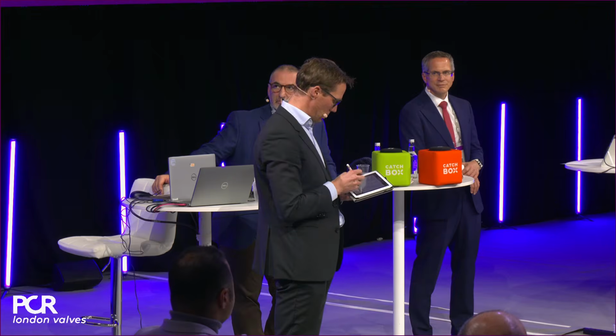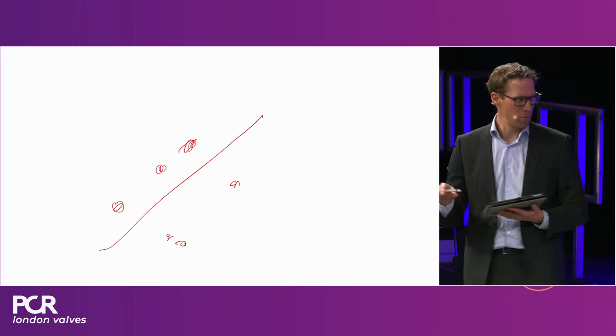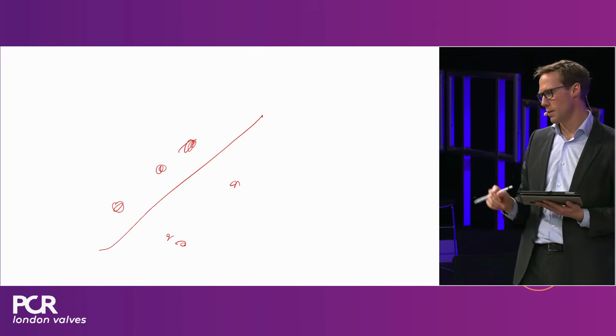So in terms of what Ole ended up with, he ended up with this in a cusp overlap view, right? In a cusp overlap view with perfect commissural alignment, you should get this, one on the bottom. Right, he got the one on the top, which means that there is some degree of commissural misalignment. But with the C-tab where it is on the inner curve, you probably have 30 degrees misalignment.